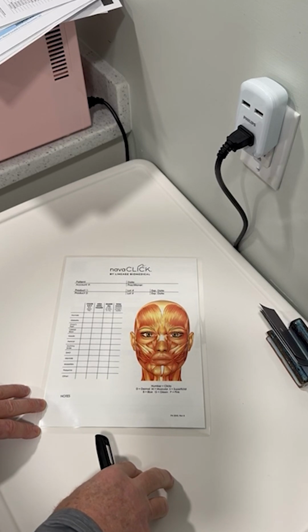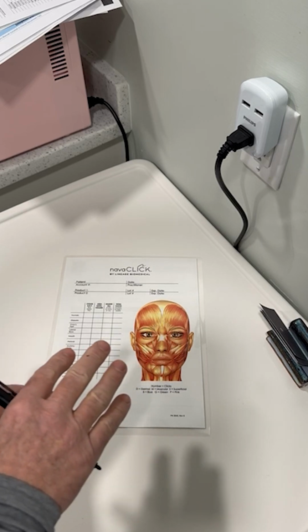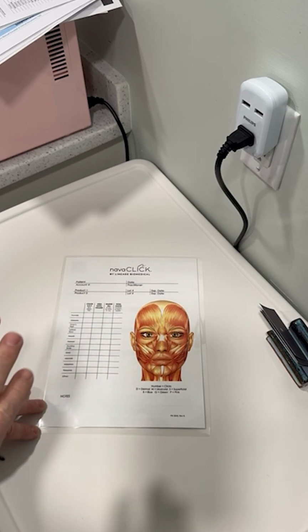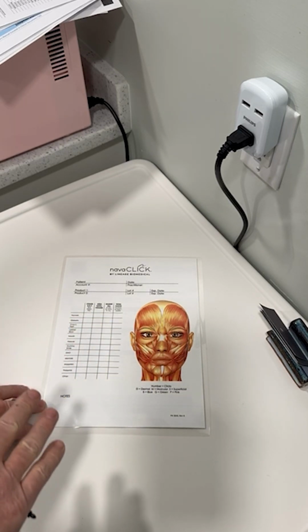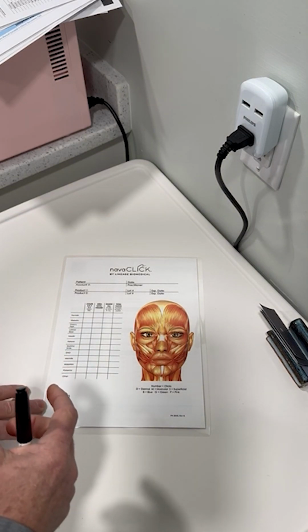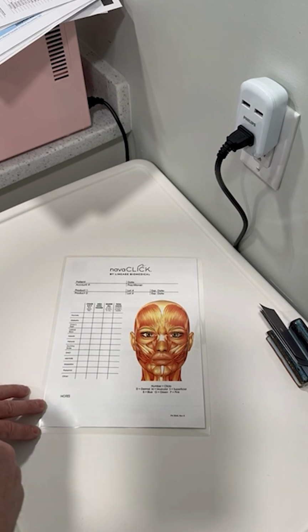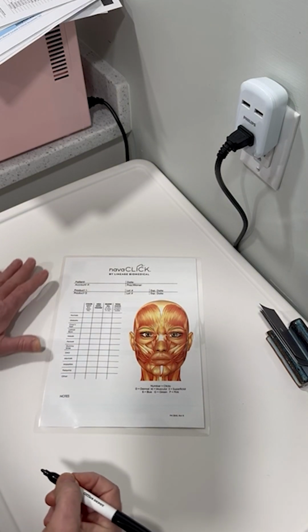I recommend for the first 5 to 6 patients, you do this mapping every single time, and it will help your mind catch on thinking clicks instead of units, and instead of guessing how much you're putting in, you're putting exact amounts in. So we're going to map my face based on what you saw in the previous video.